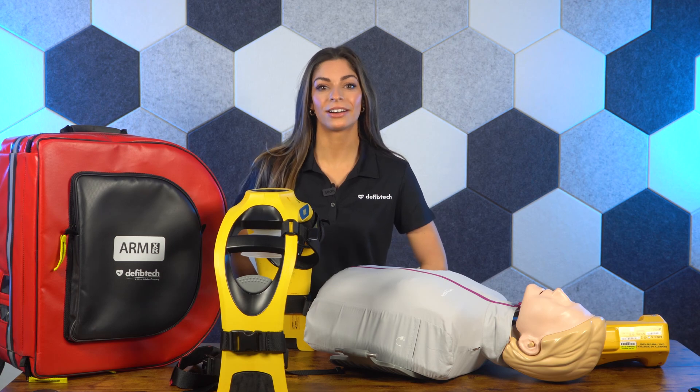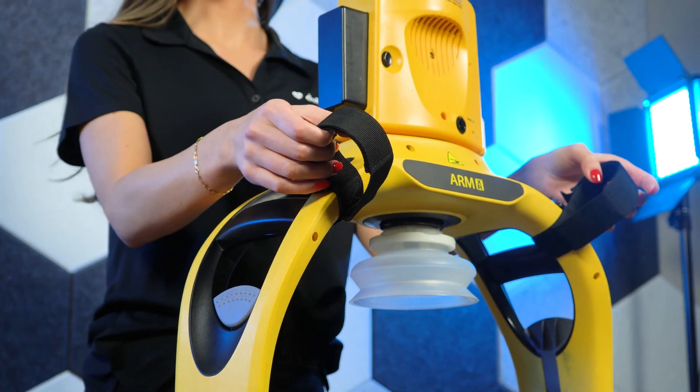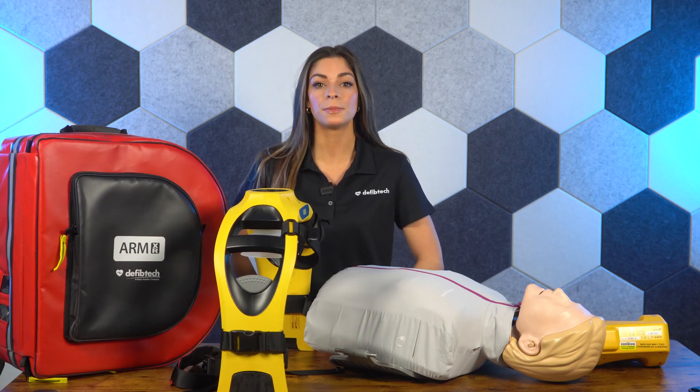A key feature of the ArmXR is the new suction cup piston design. The motor delivers precise, reliable compressions while the suction cup enables active chest recoil up to 0.6 inches.